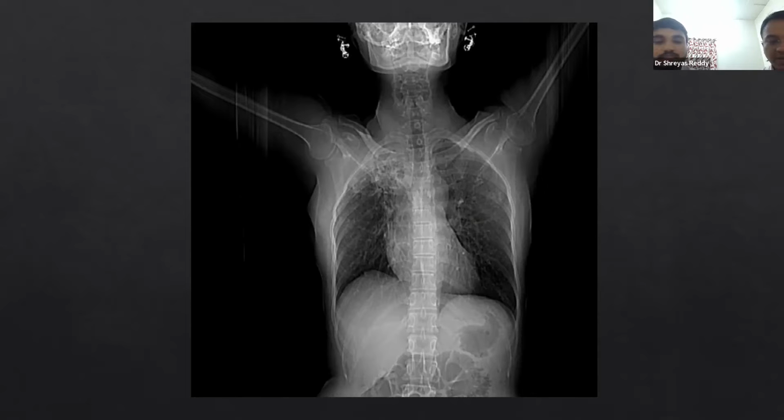So fine. The patient comes to the ER with hemoptysis and you are the attending interventionist and they give you a call. What is the next step that you would take? I would like to perform a CT angiogram. Yes. Can you briefly explain what is the CT angiogram protocol followed in your hospital for a patient with hemoptysis? For hemoptysis, we usually follow 3 phases and an additional 4th if necessary.